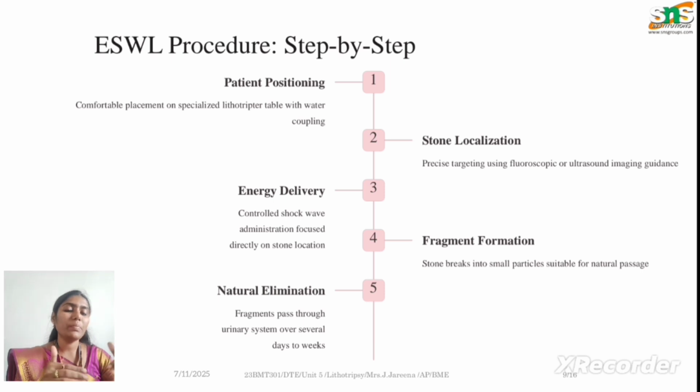All the fragmented pieces will easily get out of the body through the urinary system within 1 or 2 days. In some cases, it will even take weeks. So through the whole process, we can easily break the kidney stones and end up with no kidney stones, like a stone-free kidney. So this is the procedure of ESWL.